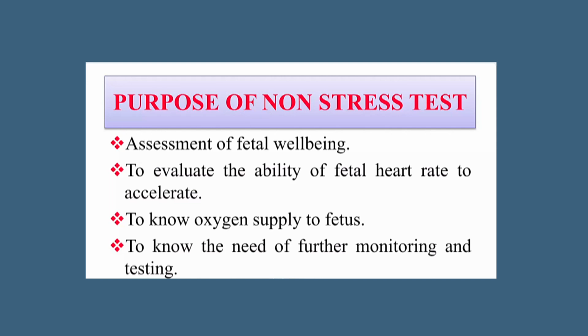Here we'll discuss the purpose of the non-stress test. These are assessment of fetal well-being, to evaluate the ability of the fetal heart rate to accelerate, to know the oxygen supply to the fetus, and to know the need for further monitoring and testing. So these are the purposes of the non-stress test.